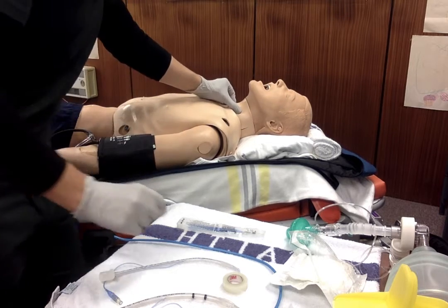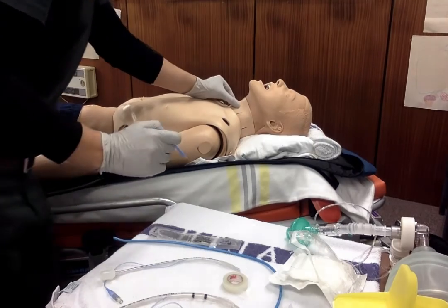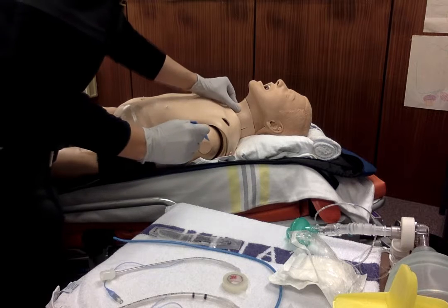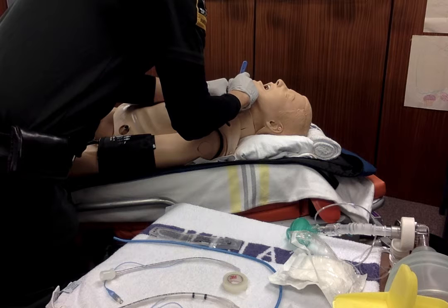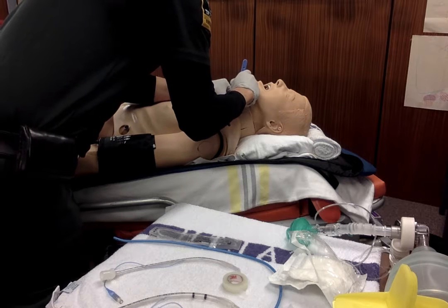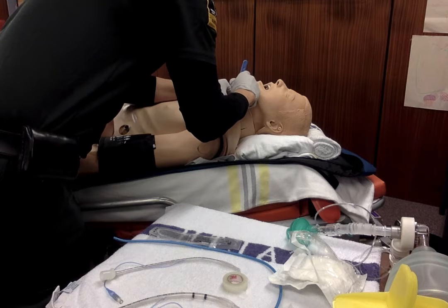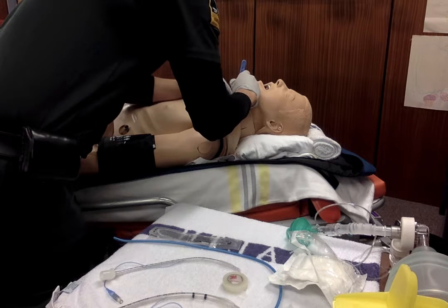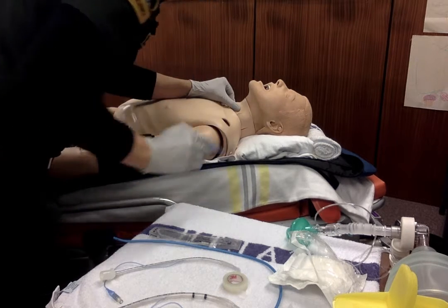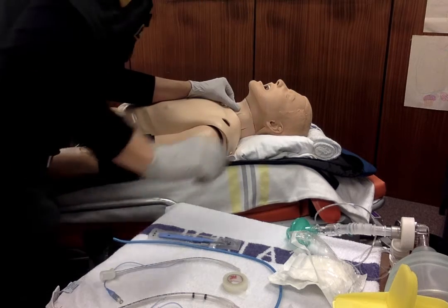Once we've found that, I'm going to take our scalpel and stabilising the area using a bit of skin traction, I'm going to make a 4 to 5 centimetre vertical incision until we have made it through so we can see the cricothyroid membrane. Once we can see the membrane and we're happy we're in the right spot, we can palpate if we need to.